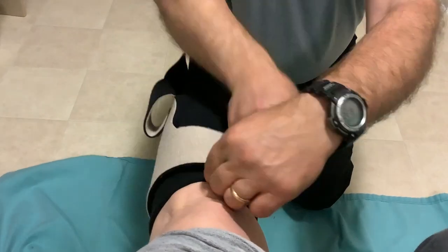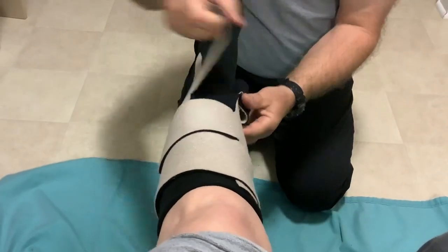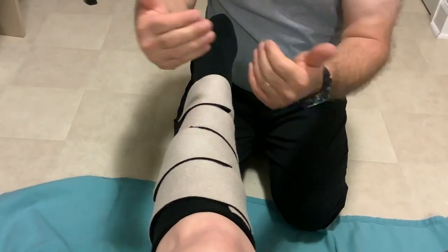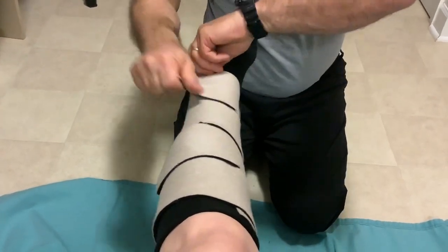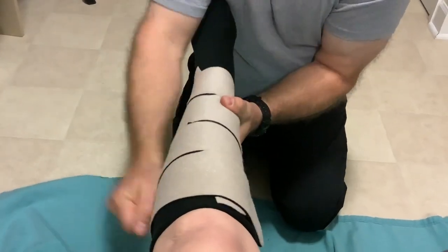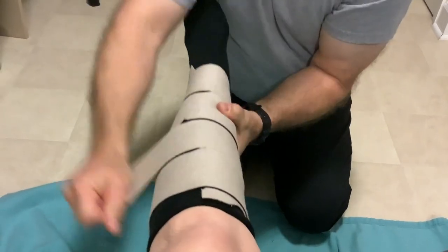Take each strap and gently pull it across. You don't have to worry about how tight it is or if it's perfect at first, because you're going to keep going back and re-snugging them. You can pull them one at a time or two at a time. The top and bottom have a little tab you can pull from, which gives you a little bit more purchase.